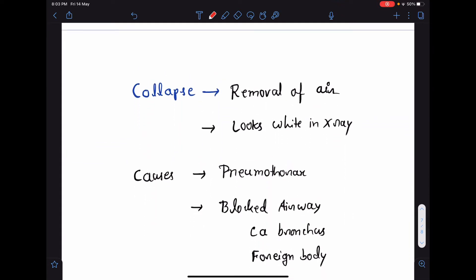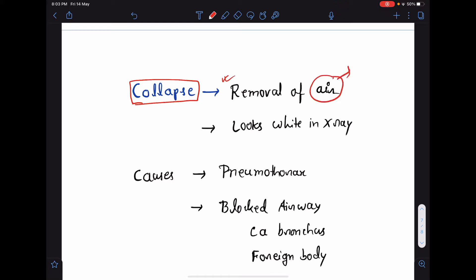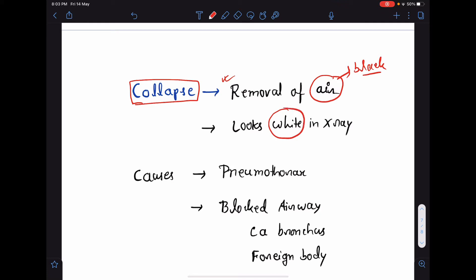Now, what actually is lung collapse? Lung collapse means removal of air from the lung. We know that air looks black in a chest x-ray. So, when there is removal of air from the lung tissue, it will look white. So, collapse looks white in chest x-ray.